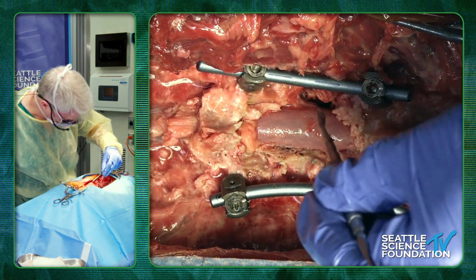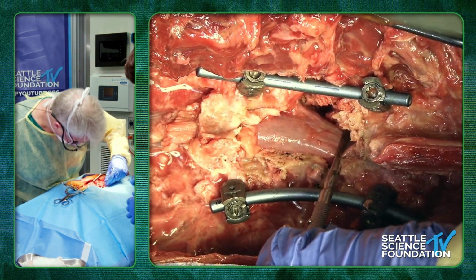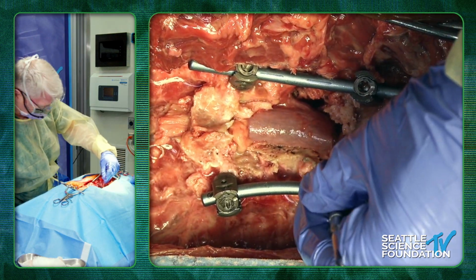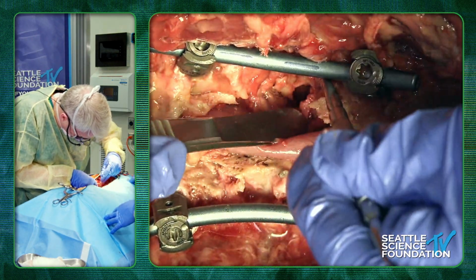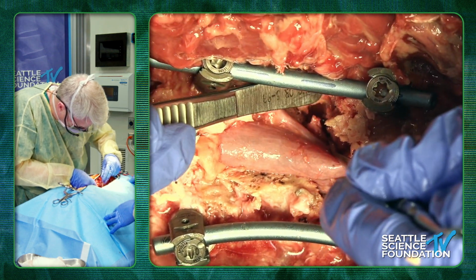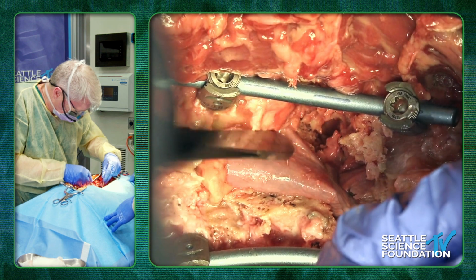So let's find the other nerve root there. That's right here. You can see the other nerve root right there? We're starting to see it, yeah. That's right there.